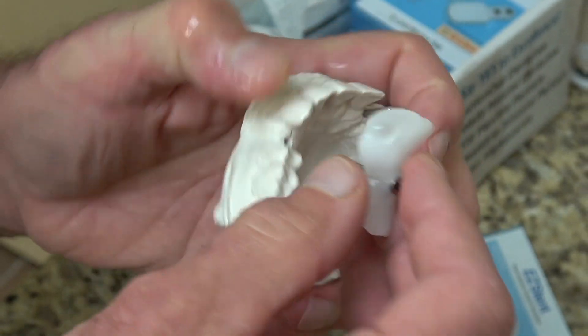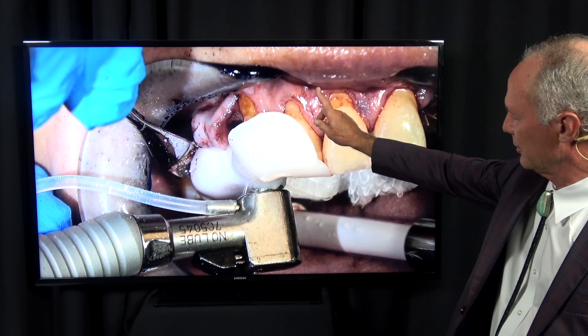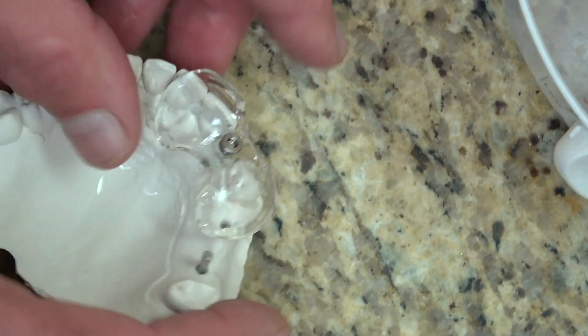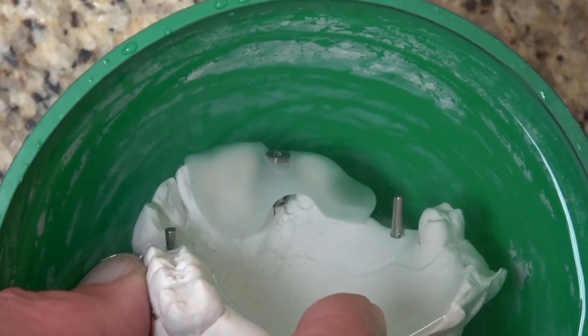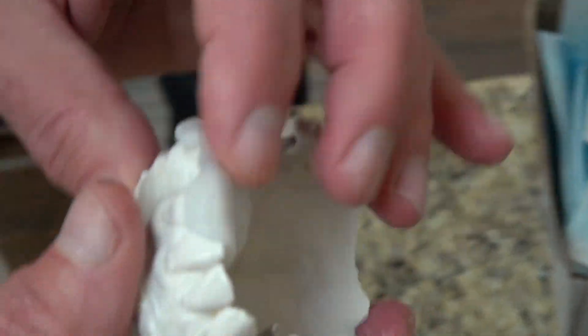Then put it in cold water — right under the water faucet is fine. That makes a nice guide. You want the cylindrical part to be on the stone. In the mouth, the pilot drill goes through — use the extra long pilot drill that comes with the system. If you use a normal pilot drill it's a little too thin and has room to move, so you're not necessarily hitting the exact spot. The Easy Stent system's pilot drill is a little wider so it fits perfectly in the cylinder. Put the cylinder on top of the post and down to the stone, then put it in cool water and it turns back from clear to white.